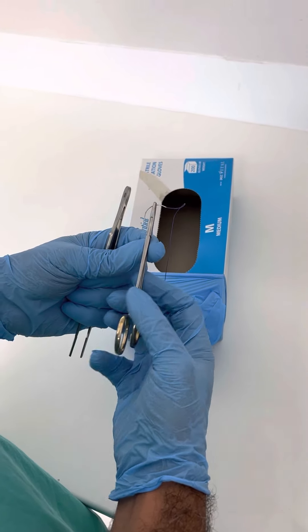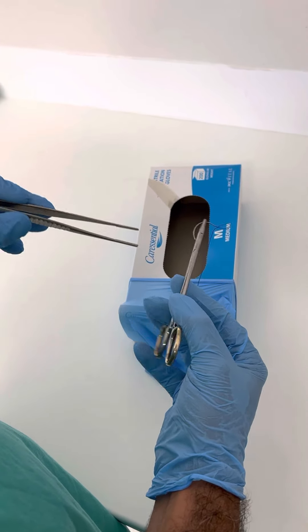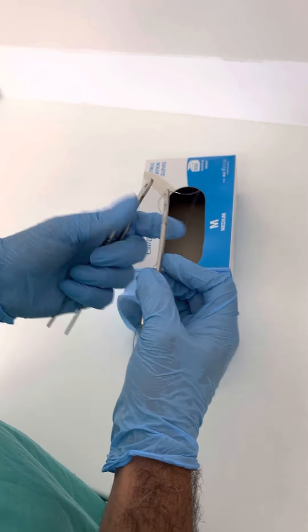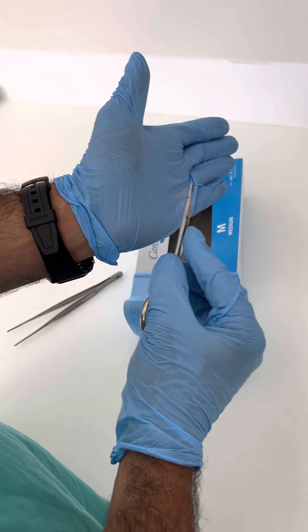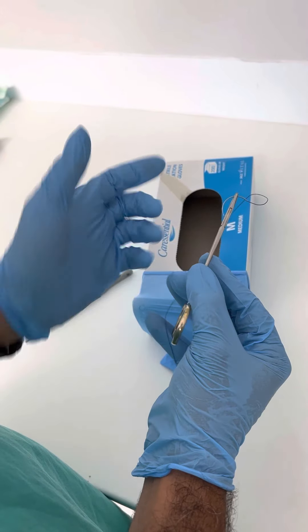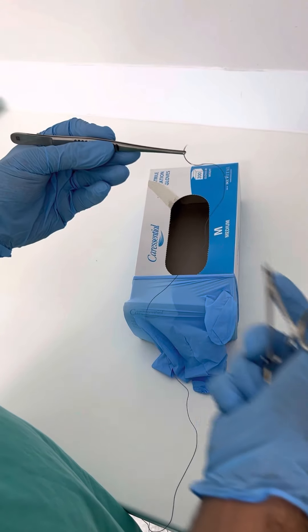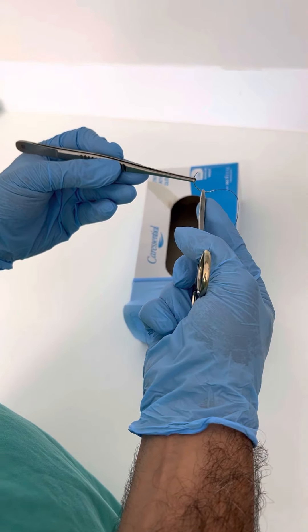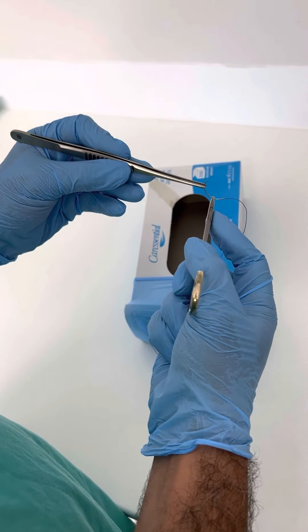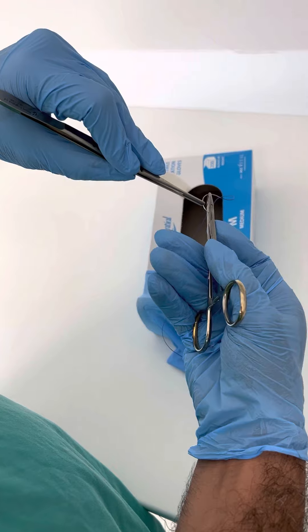The needle at the moment is in a safe mode — that's the way it's been given to me. It's safe because the tip is less likely to injure anybody, myself or people around me. The way you make a needle safe is you swivel it so that the tip is touching the body and then you click it like that.